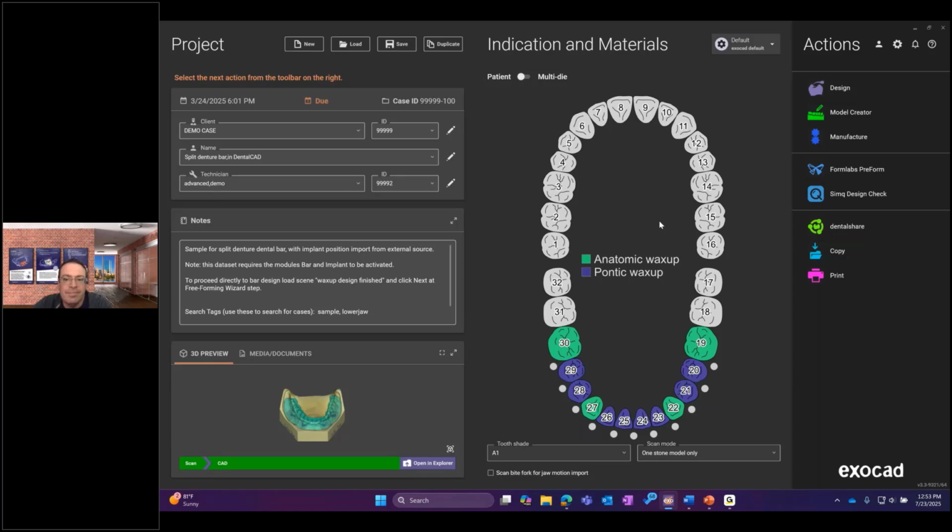So you could just create a new ticket with our team, tell us what behavior you're seeing, or maybe it's a feature that isn't involved in the split bar feature that you want, an additional parameter or something to make it more user friendly. There we go. Thanks, Lucas. So just send us that feedback, and we'll be happy to look at it.